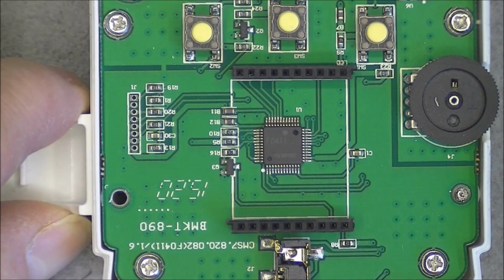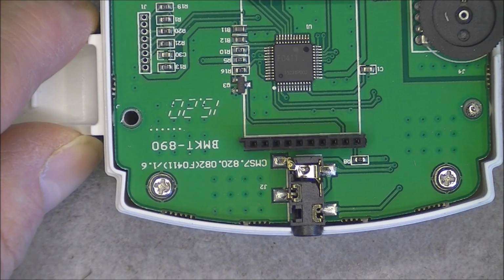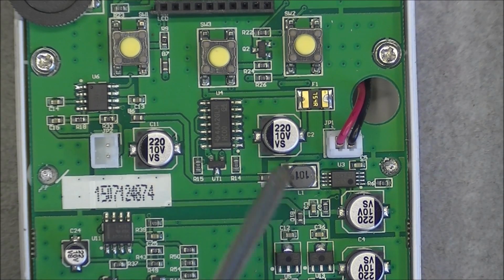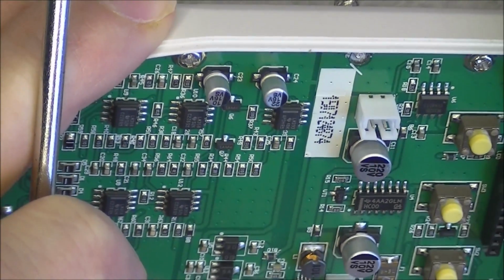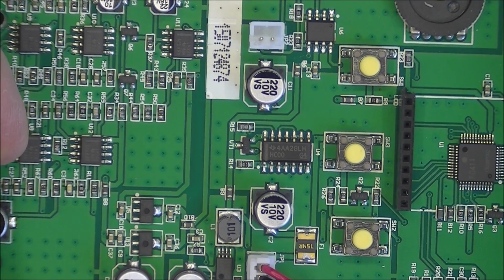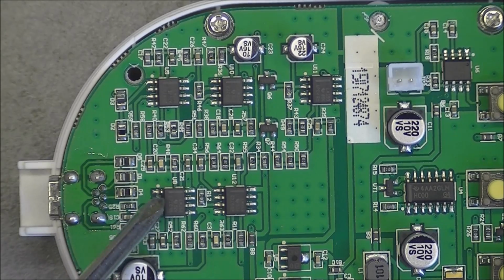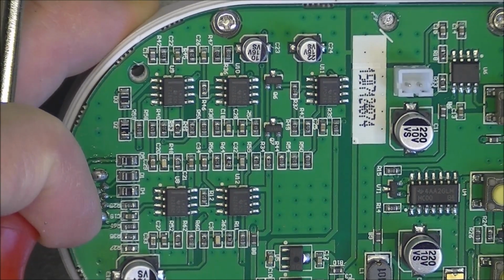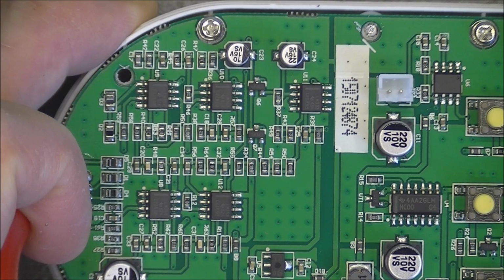I will try to read it. F0411 does not tell what it is. Here is a jack for headphones, and for the electronics here are the contacts from the battery, some power supply conversion stuff probably, a fuse here, and just a few ICs. This one here, and probably the front end here coming from the probe. What seems to be 5 similar stages with LM358 op amps. I guess they are op amps, as you can see, just surface mount resistors and capacitors.